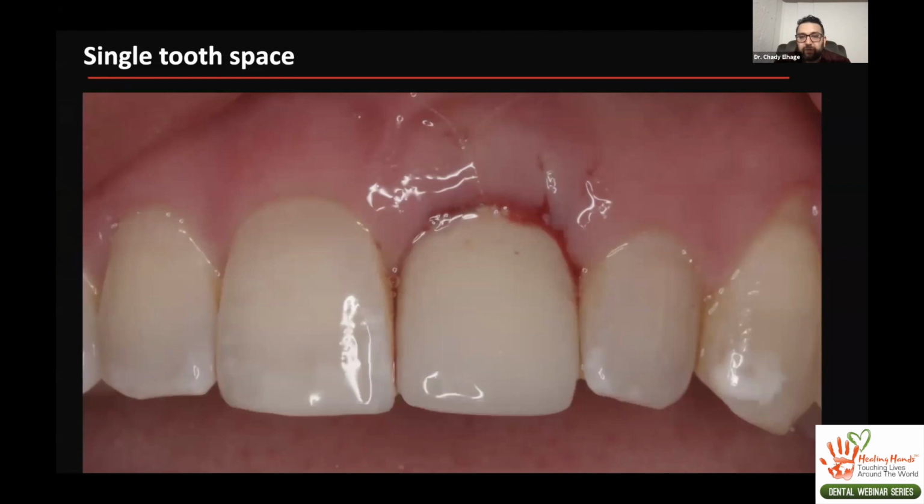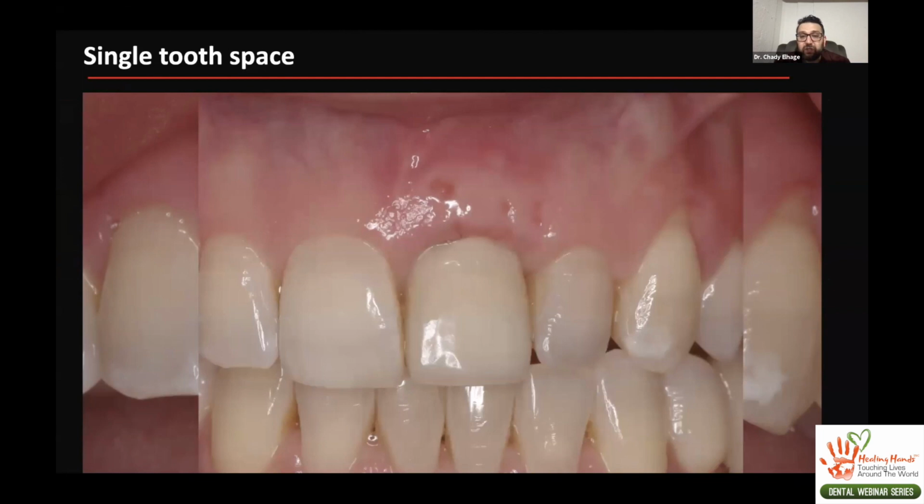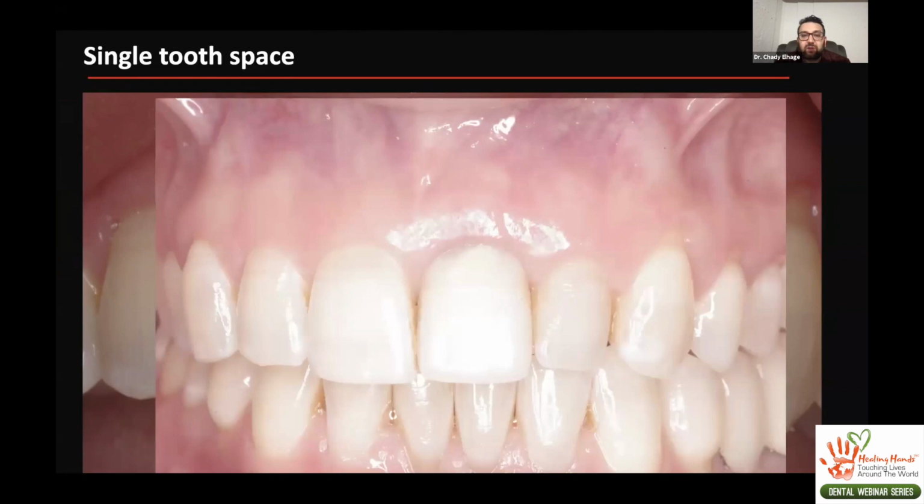Just a couple sutures. There's some tissue under there. There's some bone in there. That's her crown, her restoration. How things are healing. Tissues have resorbed. And then eventually you can see how that papilla fills in. And we've eliminated any loss of tissue. We've preserved what she had there. You can see symmetry-wise, things look very, very nicely.